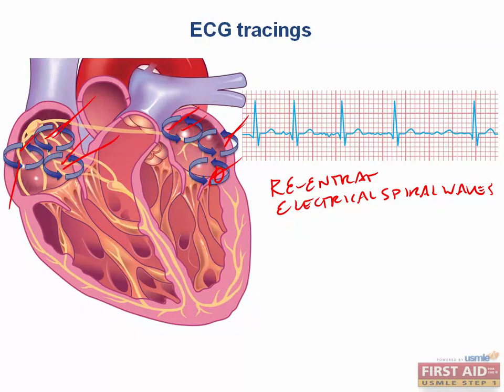When the atrial depolarizations are all out of sync, we do not get the summation into one large P wave. Rather, your electrodes detect these irregular individual depolarizations that are occurring in an unsynchronized fashion. And these show up as these little baseline quiverings because it's trying to read all these different depolarizations. They're occurring at different moments in time in different directions. And that gives you a very irregular baseline.